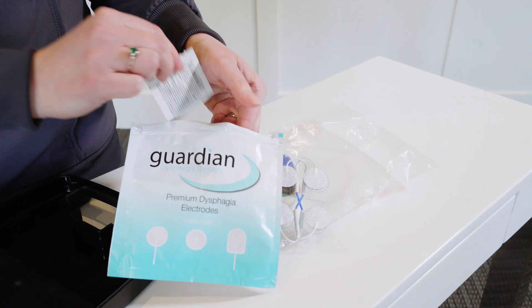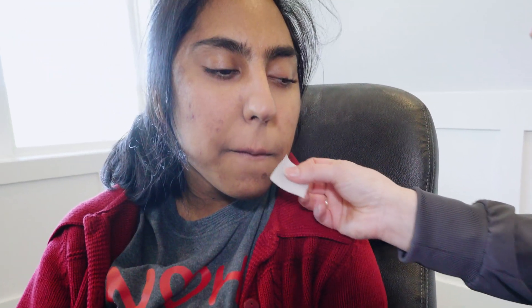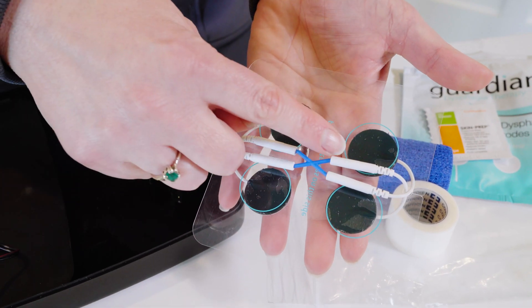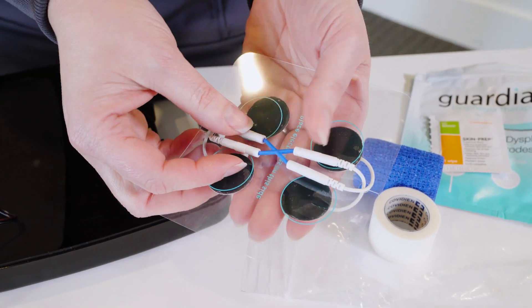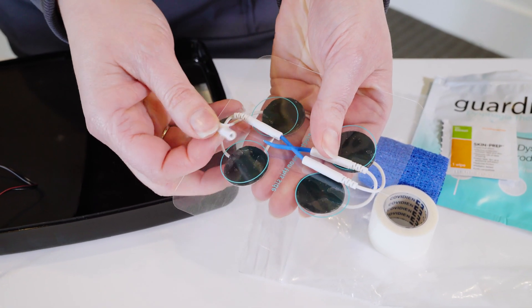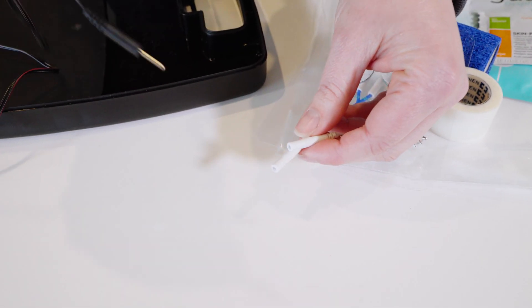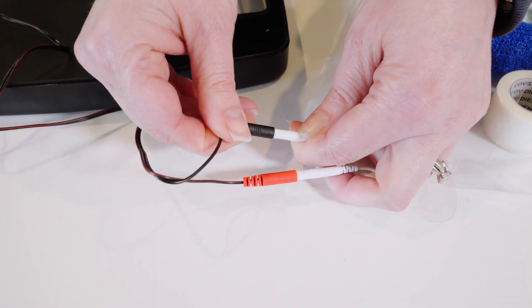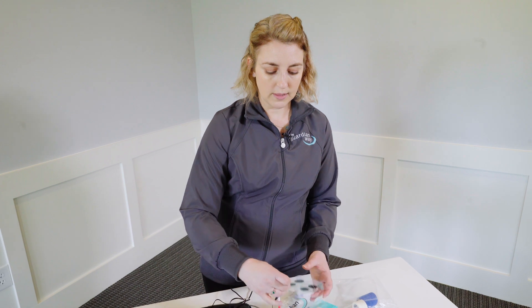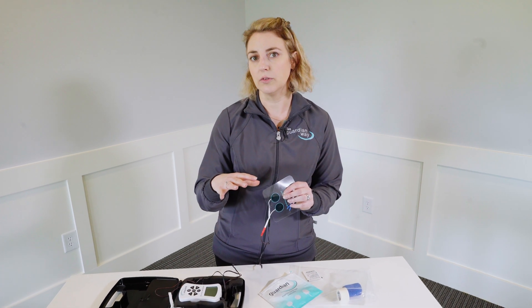Inside the bag you'll also have skin prep pads. These are going to be utilized before you place the electrodes on the patient. The electrodes are shipped with a little plastic X on the back — that's just to keep them in place — and you'll unplug the set that you want to use first; there's no reason to keep it once you've unplugged them. When you're ready to get started, they plug into the lead wires. It's really important that you don't touch the gel on the back of the electrode, because that can cause an area where the signal won't reach the patient.